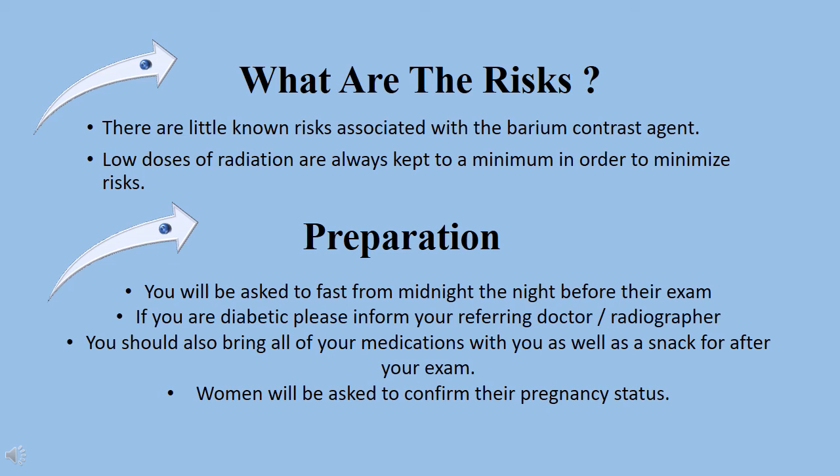If you are taking any medications or have any allergies, you should inform your radiologist beforehand. If you are a diabetic, you should continue to take your medication as normal, and please inform your doctor or radiologist of your appointment, and it may be scheduled earlier. It is advisable to bring a light snack into the exam with you.